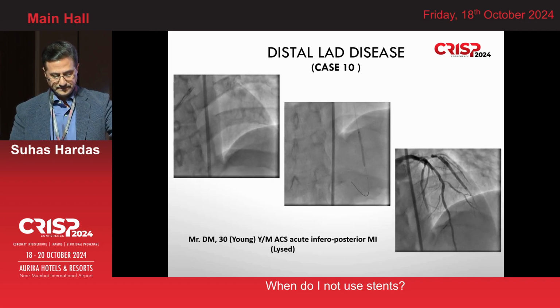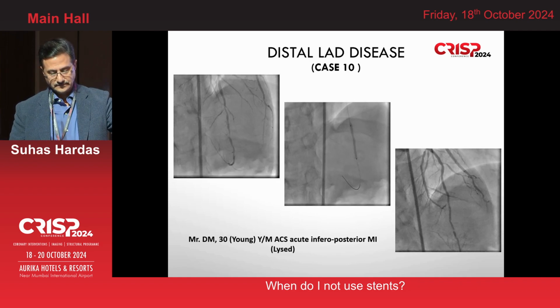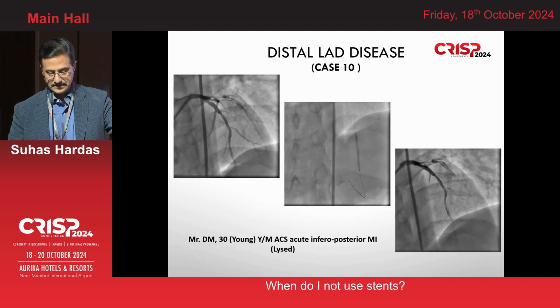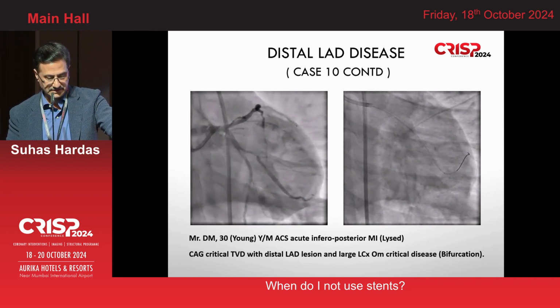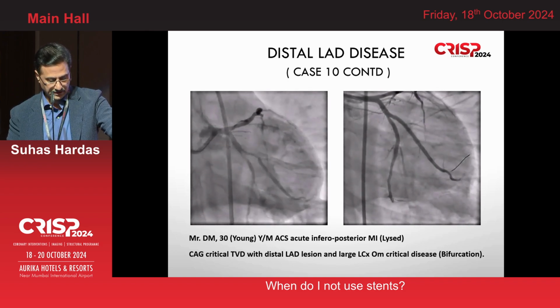One more situation, a very young fellow presenting with a bifurcational lesion in the circumflex OM and distal LAD disease. The circumflex and OM disease was dealt with a bifurcational strategy, and distal LAD was balloon dilated with a drug-coated balloon.